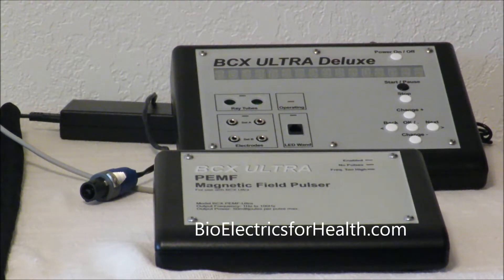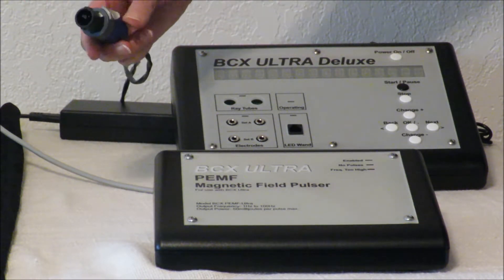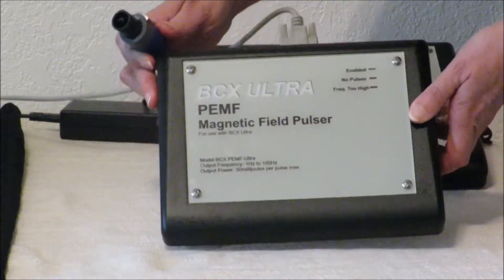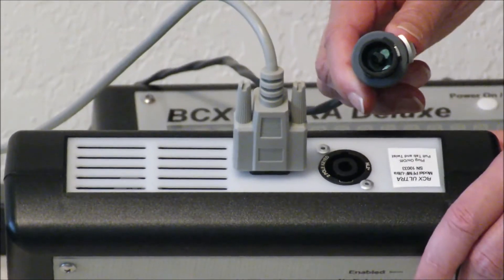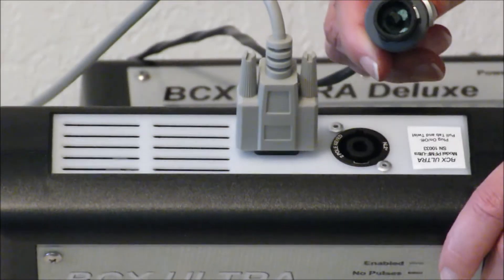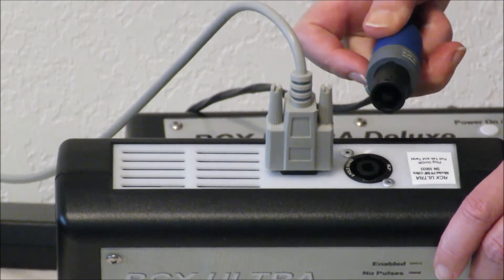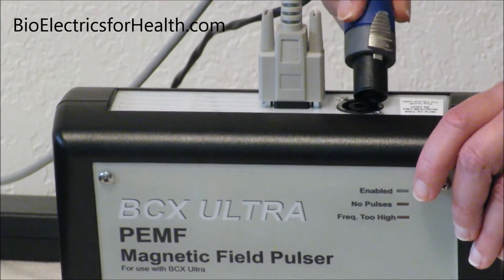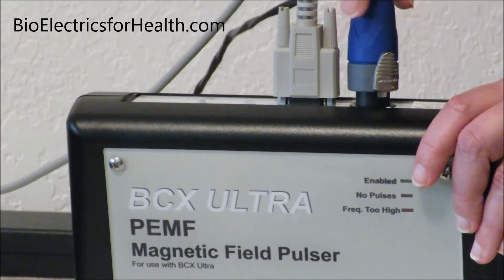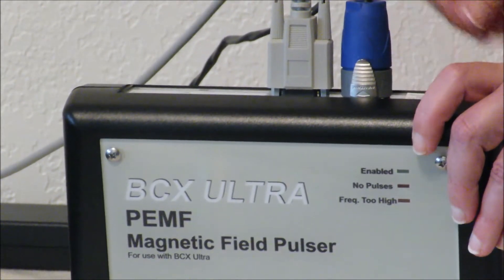Now we are going to hook the mat into the magnetic pulsar unit with this round cord and round fitting. There is a round plug that plugs into the back of the magnetic pulsar — it is the only round receptacle. There are little notches that you must line up to get it plugged in. You line up the little notches and push it in firmly, then you turn slightly and you hear the click. Make sure it's very nice and tight.